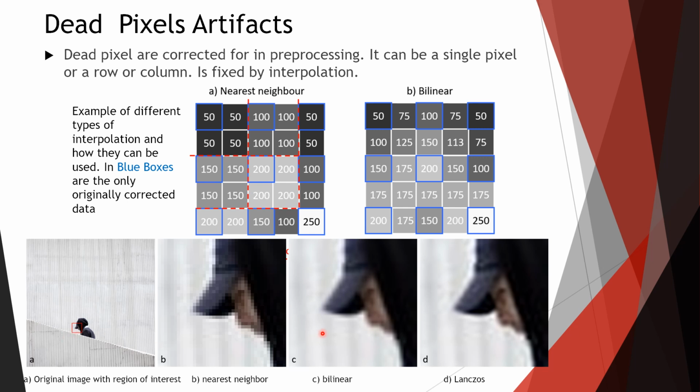This is zooming into this image right here. The bilinear is going to be much more smooth, right? And we know this hatch should be curved and everything, and we can actually see it, where it's not just like the edges unknown right here, right? The face is not clear. Here we're getting some more clarity in it. And the Lanczos, I suppose, named after somebody, it's capitalized, is another technique, and mathematically they're beyond what we need to know, and there are many other different types that are utilized, but we can see more details here, even compared to the bilinear.